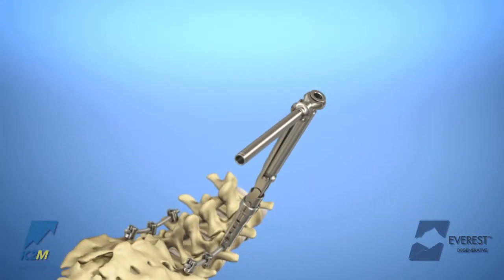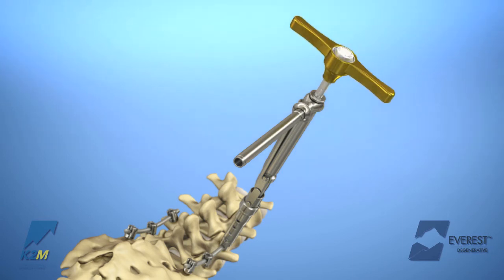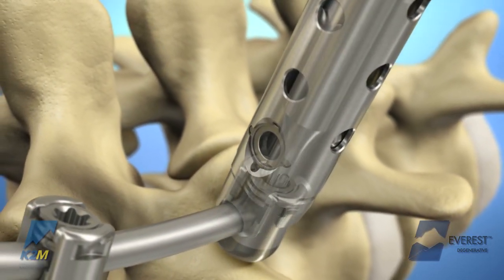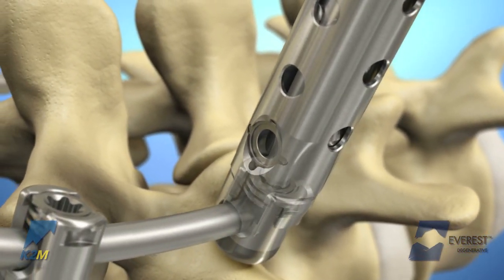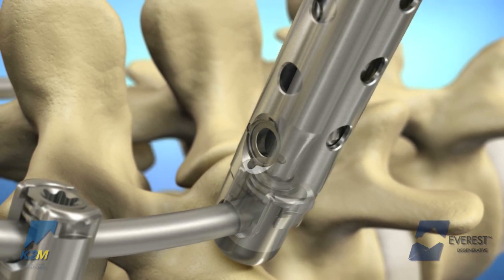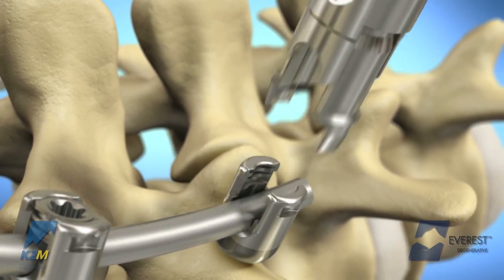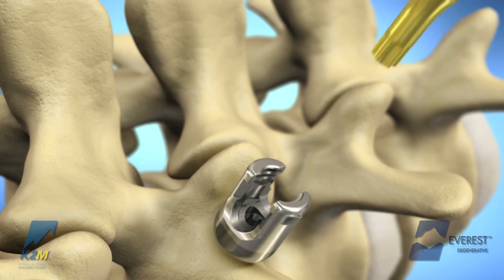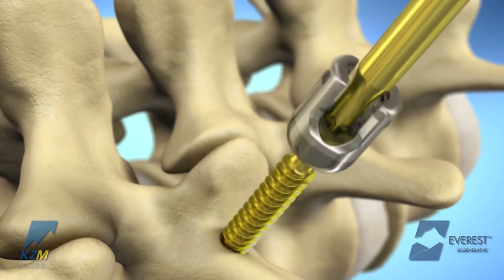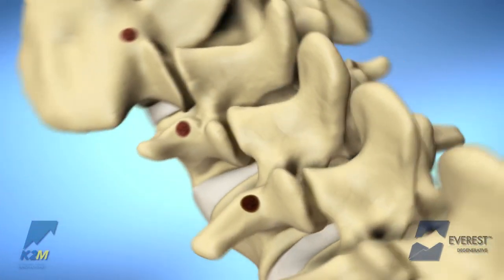Once the set screw in the Everest implant has been final tightened, it may be loosened using the set screw removal wrench. Insert the removal wrench through the anti-torque device and turn the handle of the instrument counter-clockwise to loosen the set screw. The screw may be removed with the screw removal shaft and T-handle. Engage the driver tip with the inner hexalobe of the screw and turn in a counter-clockwise direction to remove the screw.